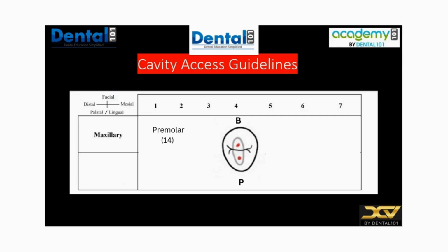So as you know, the first task that came was the upper premolar, which is the 1-4. So this would be the shape of your access cavity for the 1-4. The 1-4 has two canals, the buccal and palatal. So based on that, this will be the shape of your access cavity.